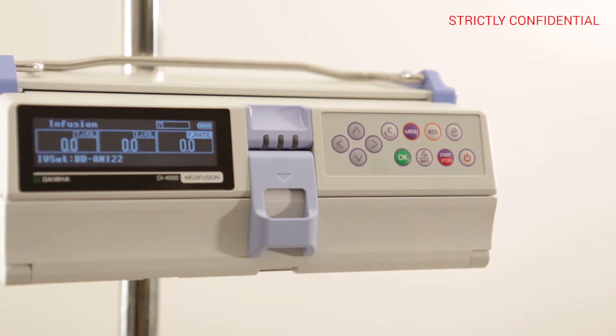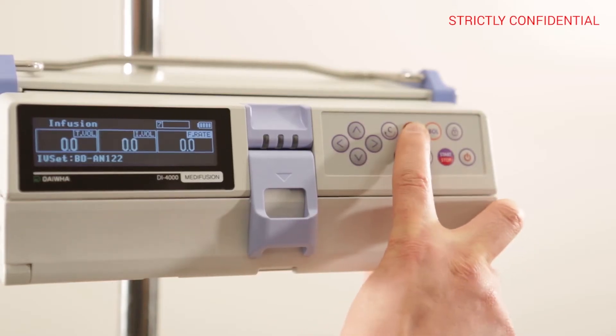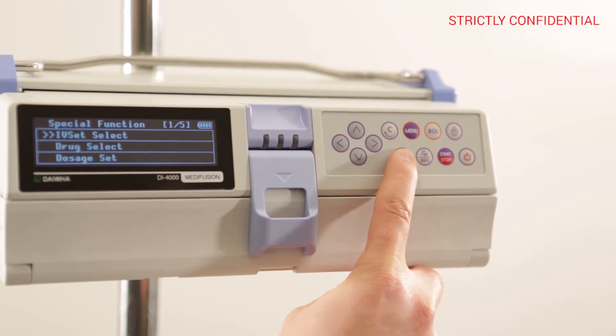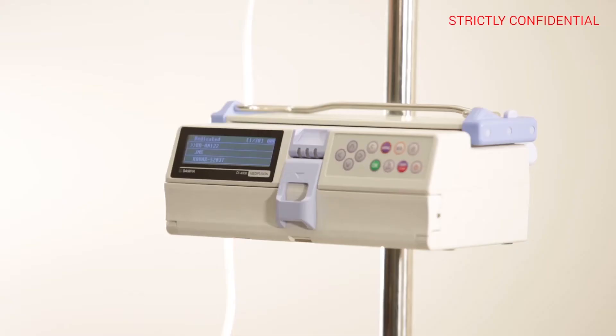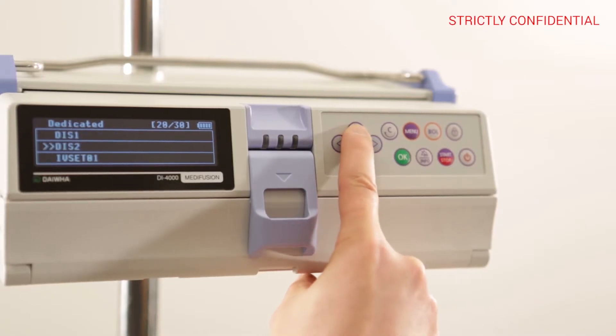IV set code setup and installation: press the menu button and then the OK button to enter the special function. In IV set, select menu, input 1711 for password to enter the dedicated menu, and choose the IS1 code. Finally, press the OK button.